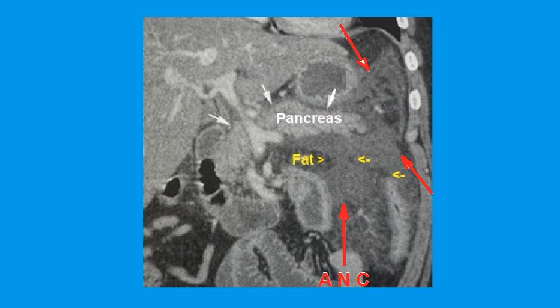Here's a case of complicated pancreatitis. The relatively normal pancreas parenchyma indicates the interstitial pancreatitis has improved, but there are peripancreatic fluid collections that are heterogeneous, with areas of interspersed fat and no discrete wall. This is an acute necrotic collection — heterogeneous, no discrete wall.